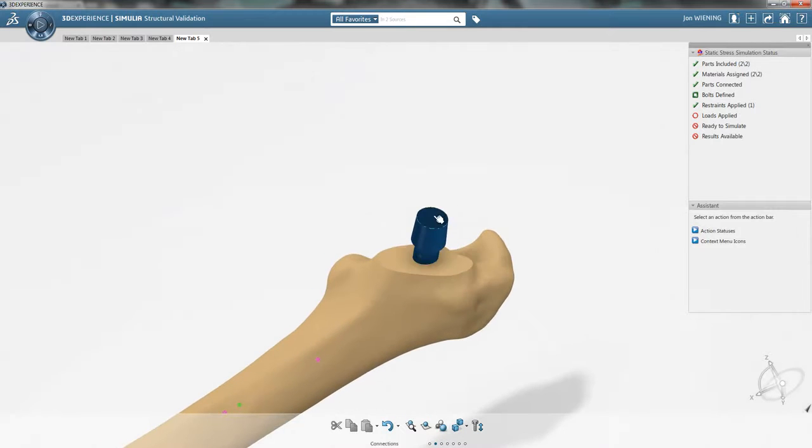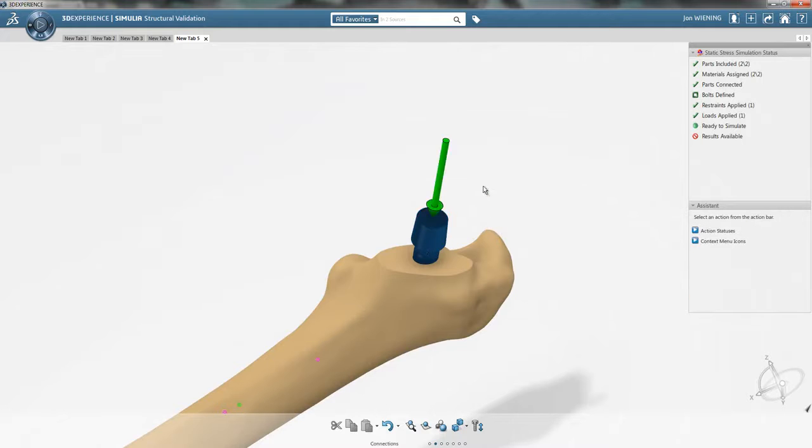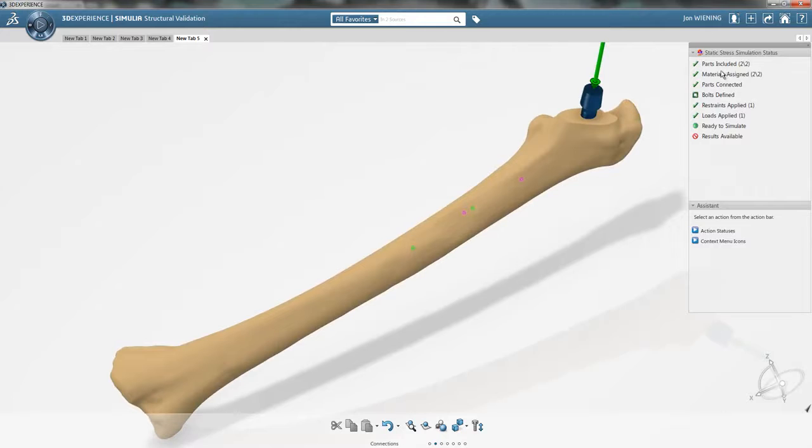I'm going to apply a load on this face here, which is the region associated with the implant. And we'll just define a normal force in this region. And you can see now we have our model entirely defined. We have green check marks indicating that everything has been minimally satisfied, at least, all the way down to ready to simulate. And now I can click on Simulate to bring up options to run the simulation.